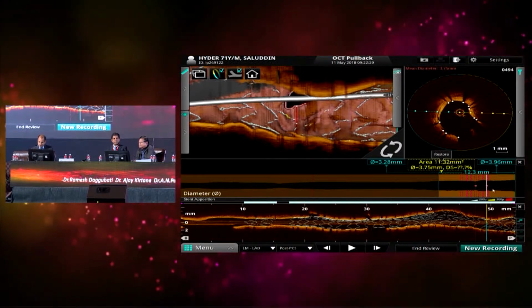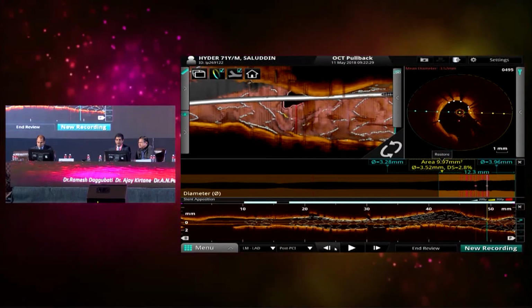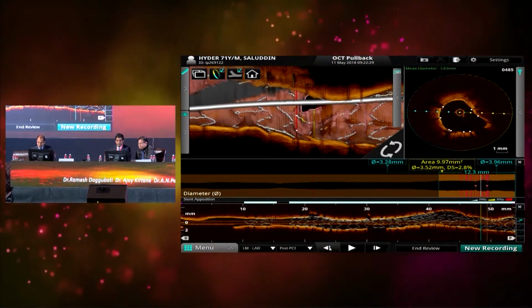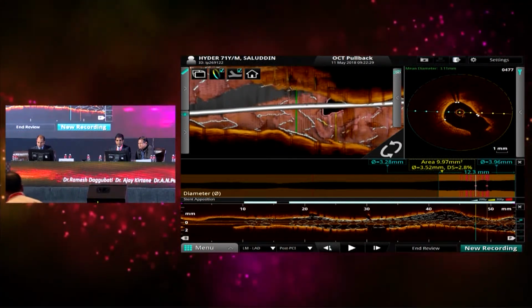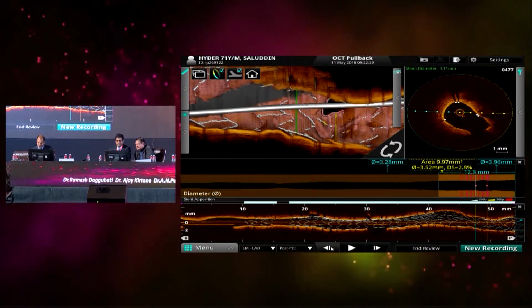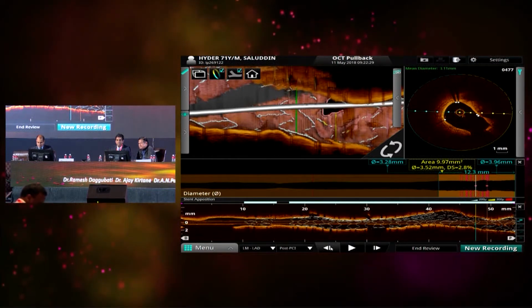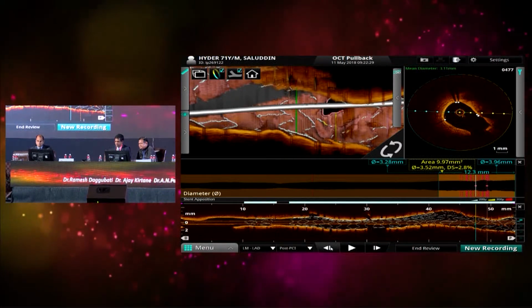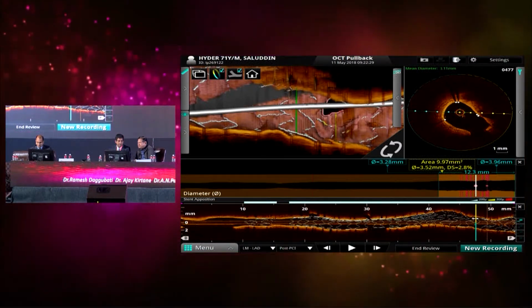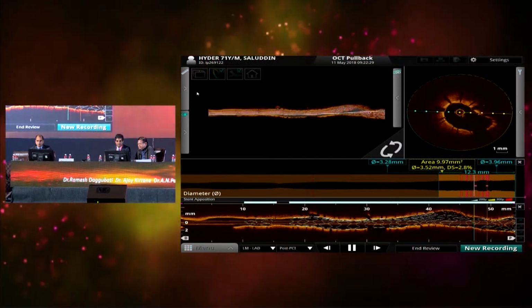Just show the OCT. So on the OCT, you can see that in one portion, it is not opposed well. Just show that point. And then the circumflex ostium angiographically looked a little pinched, but in the OCT it looks okay. So we again dilated with 4.5 with very high pressure, and show the end result. That is the end result.